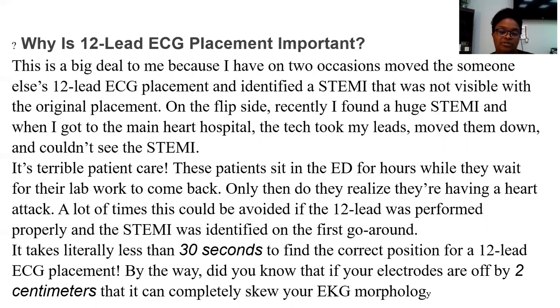And remember, your doctors are making decisions about how to treat these patients based on the results of these EKGs. Okay. It's terrible patient care. He said these patients sit in the ER, in the emergency department for hours while they wait for their lab work to come back. Only then do they realize they're having a heart attack. Okay. A lot of times this could be avoided if the 12 lead was performed properly and the STEMI was identified on the first go round. STEMI, you guys, you'll learn more about when you get into myocardial infarction later on. In later modules, okay?